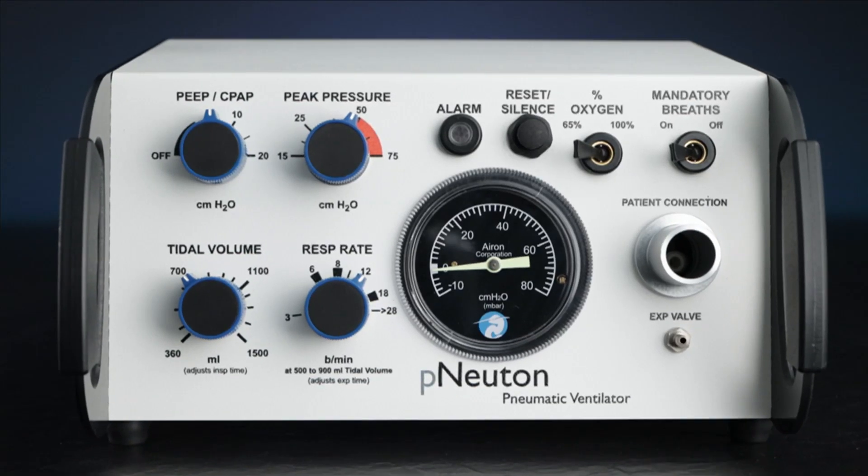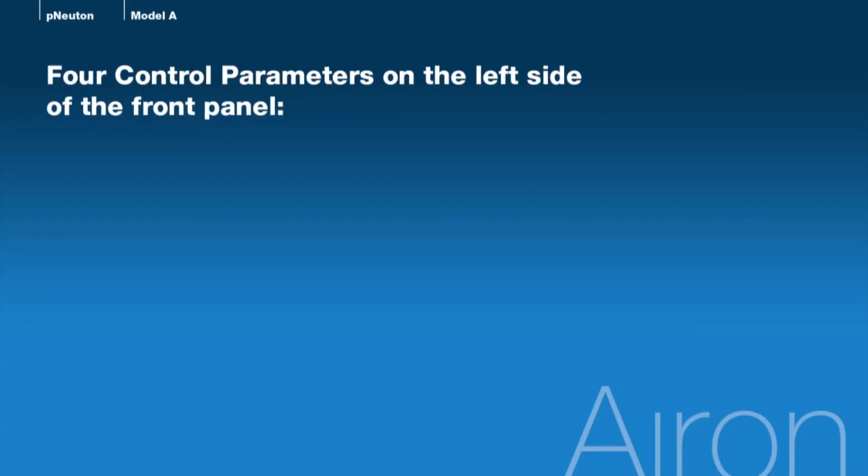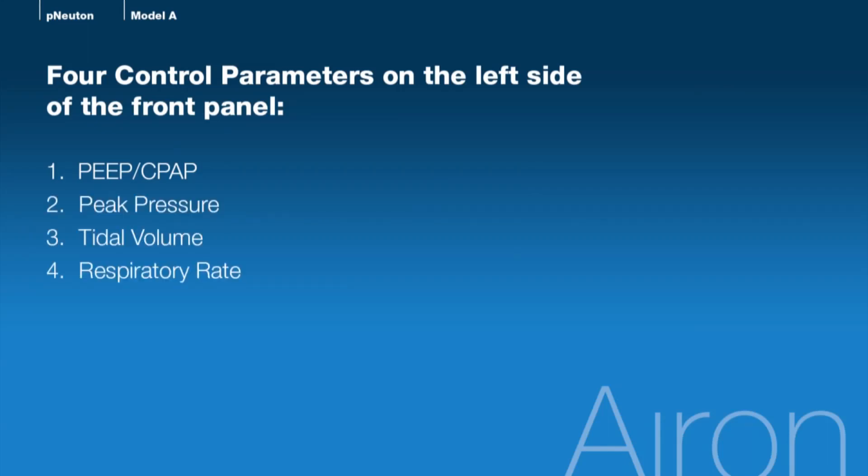Now let's move our attention to the front panel of the Newton Model A. We'll review the four control parameters related to patient respiratory support: PEEP/CPAP, peak pressure, tidal volume, and respiratory rate.